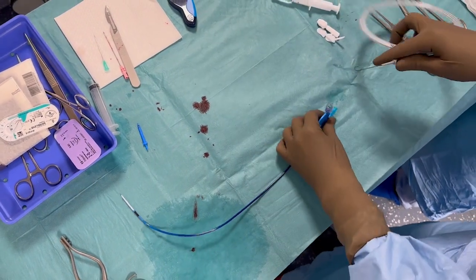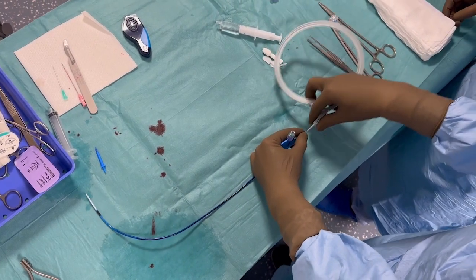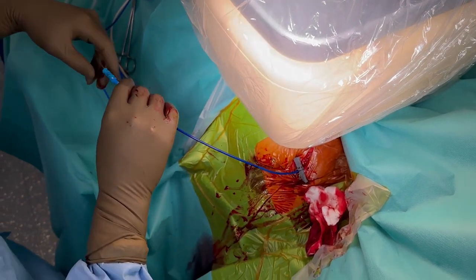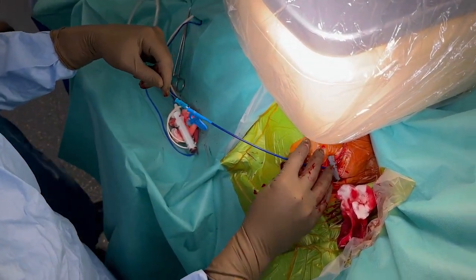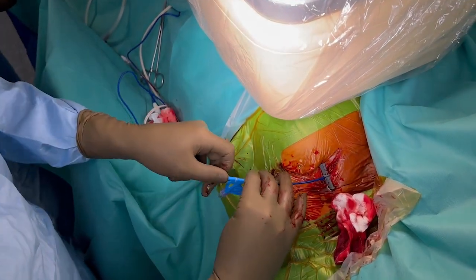In this video we will show you how to perform left bundle branch area pacing using a stylet driven lead. In a previous video we have shown you how to perform LBBAP with the more popular 3830 lead by Medtronic, which is a lumenless lead with a fixed helix.